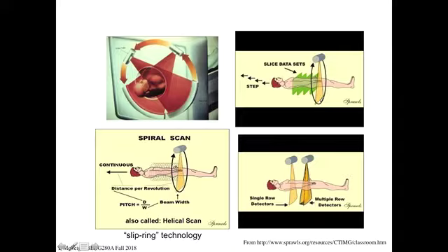And what this meant was all of the signals came out over brushes, so that essentially you had an electrical contact and a brush that, as the gantry was rotating, you had a continuous output of signal across these electrical brushes. So you didn't have to go backwards and forwards. You could just start the thing spinning and keep it spinning, right? So at that point, why not spin it fast, right? And so they did. They just kept cranking up the speed. And so these things used to spin sort of once every 2 seconds, in the days. Now it's almost 5 times a second this thing is going around.